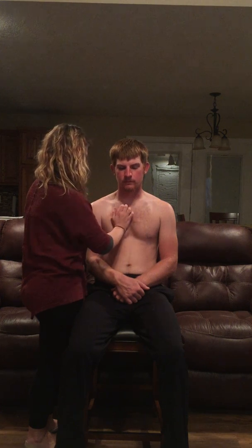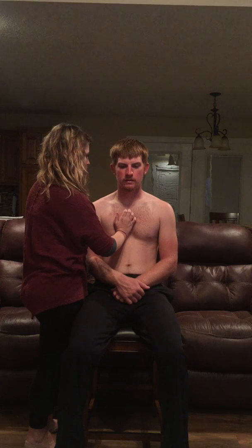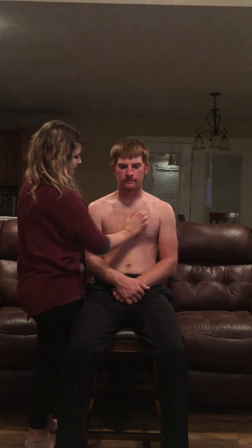Okay, and there I am assessing to make sure that vibration is present and symmetrical on both sides, meaning it's not really noticeable on one side or not as noticeable on the other. So now I'm going to auscultate his lung sounds.